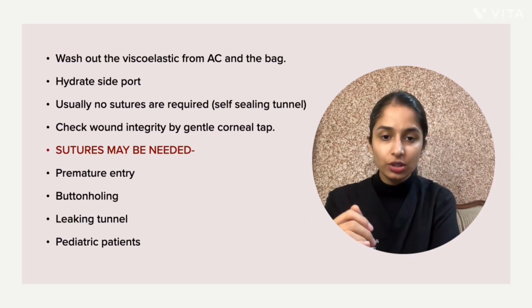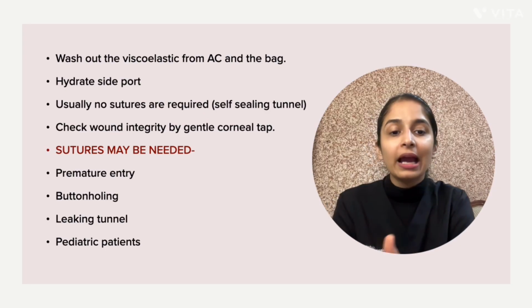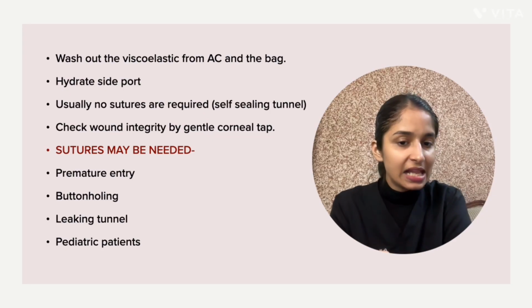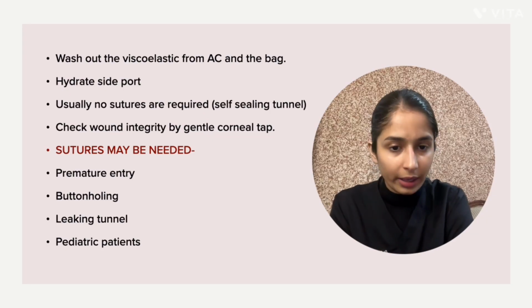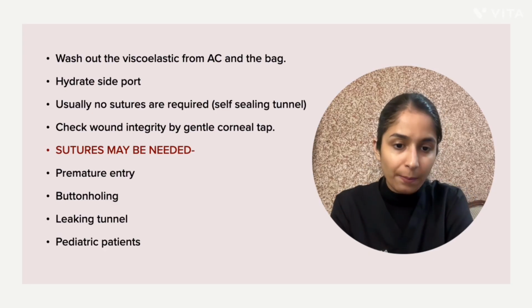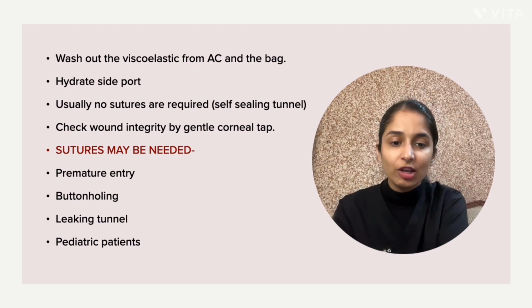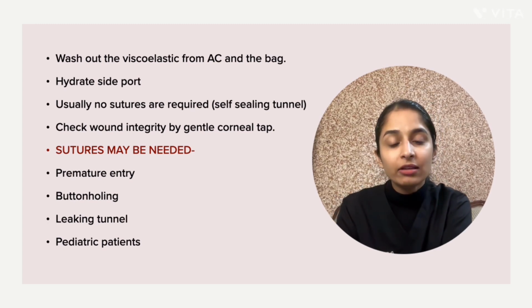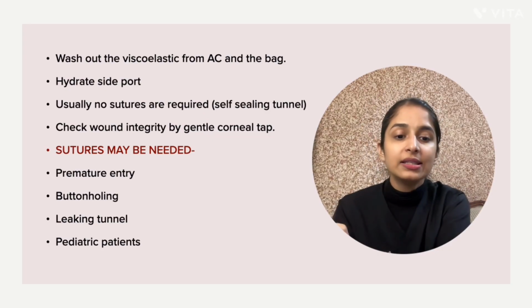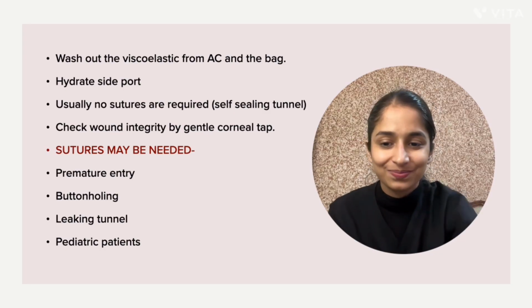After IOL implantation, we wash out all the viscoelastic from the anterior chamber and the capsular bag and then hydrate the side ports to ensure proper sealing. And usually most cases are self-sealing, so sutures are usually not required. And also always check wound integrity with a gentle corneal tap, and sutures may be needed in specific situations in cases of premature entry, buttonholing or leaking wounds or pediatric cases. Always ensure a secure leak-proof wound to prevent post-operative complications.